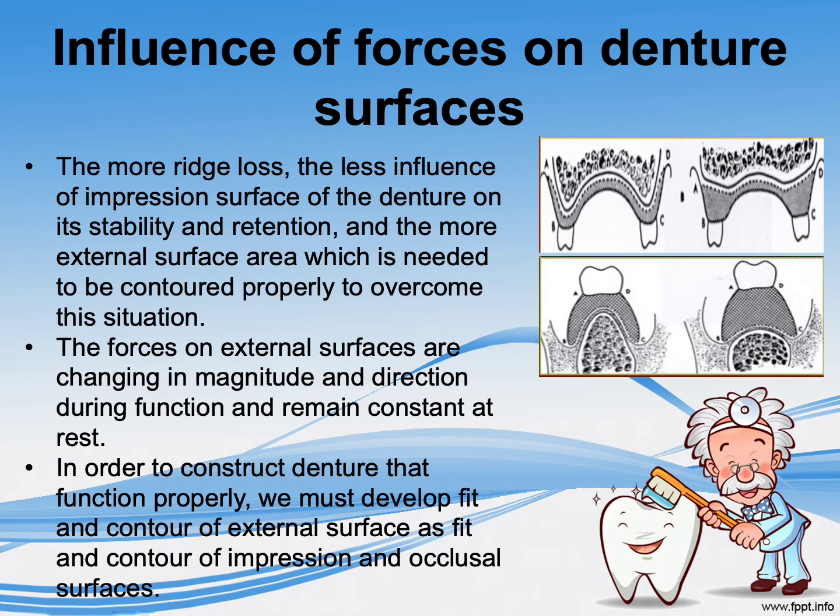Influence of forces on denture surfaces. The more ridge loss, the less influence of the impression surface of the denture on its stability and retention, and the more external surface area needs to be contoured properly to overcome this situation.